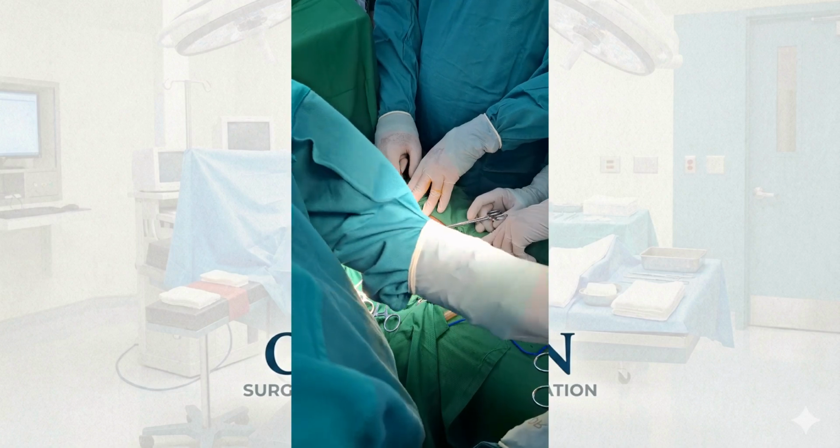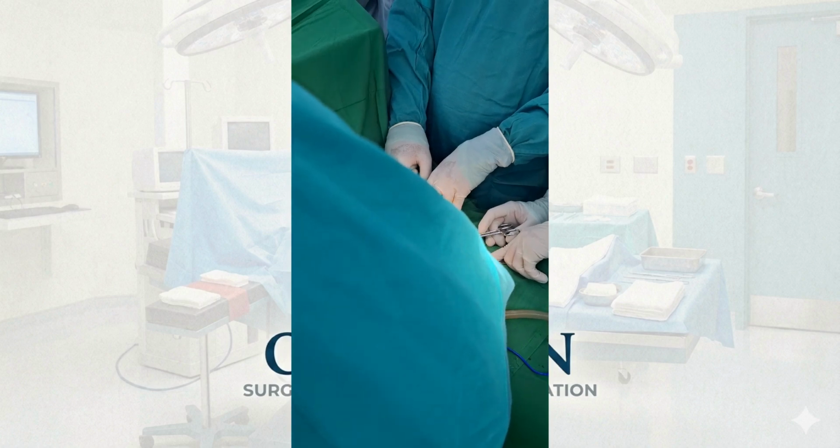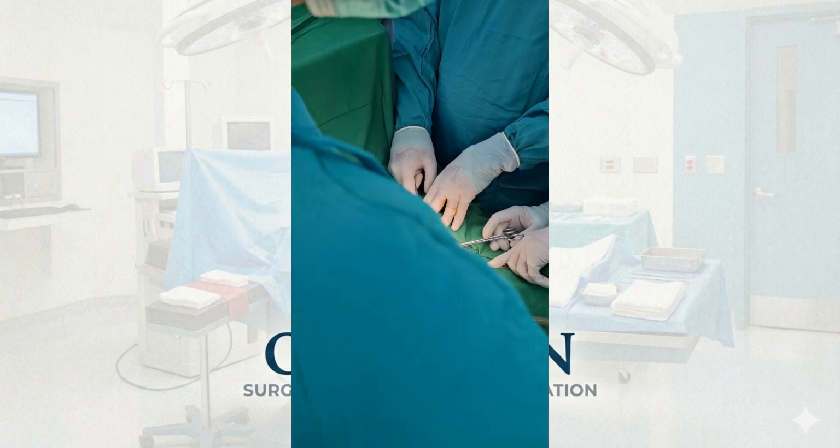The appendix has been successfully removed and sent for pathological analysis. The area is cleaned and the incision is closed with professional suturing.